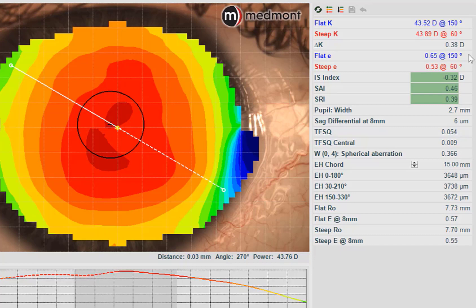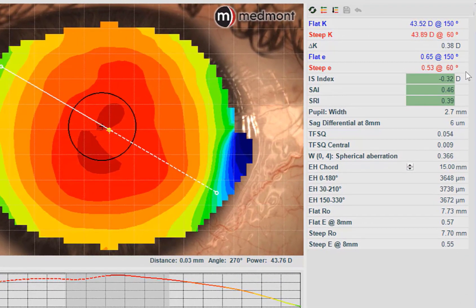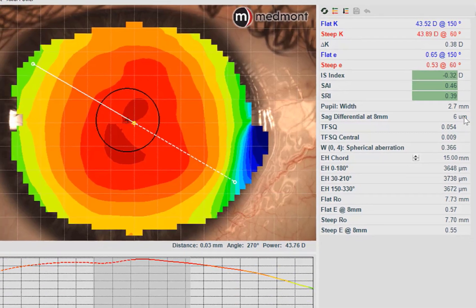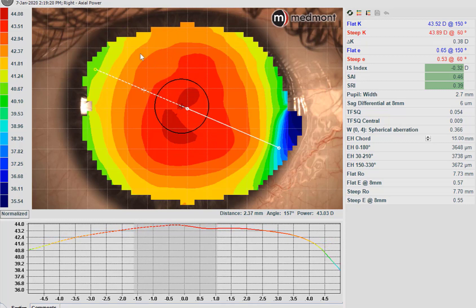Let's look at the eccentricity. The E value of the flat meridian is 0.65, meaning the rate of corneal flattening of this eye is very normal — median would be around 0.65. The eccentricity along the steep axis is 0.53. There's a very small difference between these two. When the flat E and the steep E are relatively close together, that tells you the peripheral corneal shape is relatively symmetric. That's also seen with the SAG differential attribute, which shows the height difference between the flat axis and the steep axis is only 6 microns.